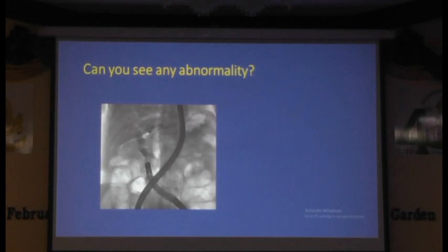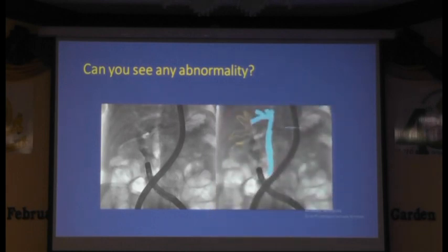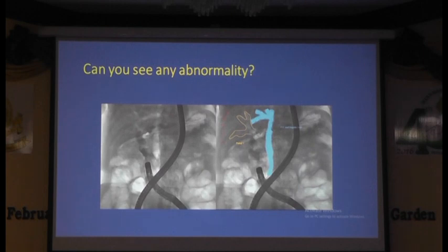Looks like air filled the bile ducts completely. Actually, this is a massive air embolism. At that time, we did not use CO2 insufflation, which is only room air. So this patient, unfortunately, died, and we thought that air had entered the portal vein and IVC. So these days, we no longer use room air.